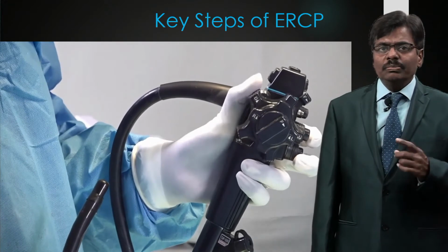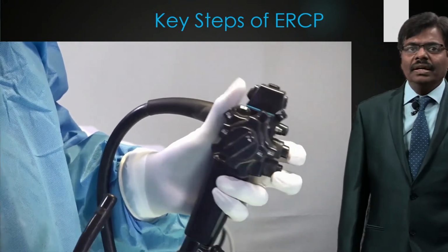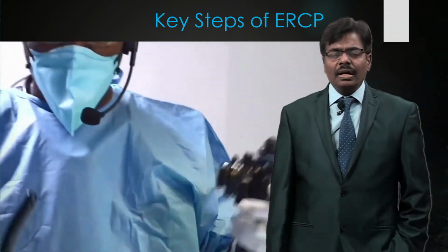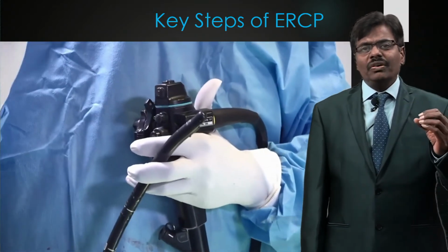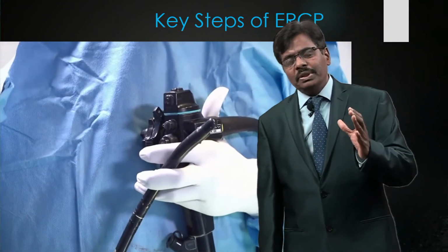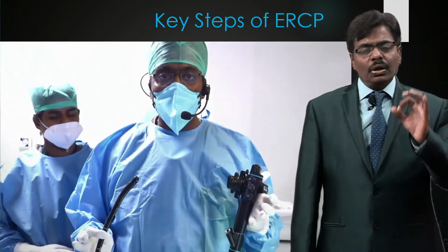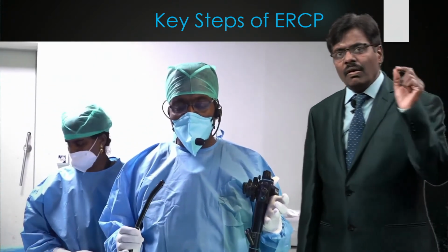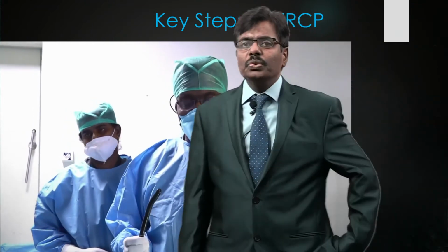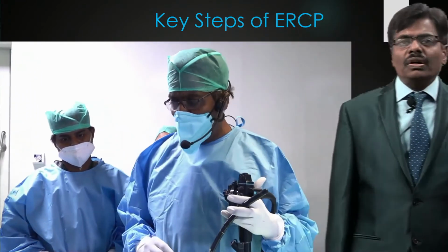So that is controlled. Big wheel, small wheel, next to this big wheel is the elevator, as you can nicely see demonstrated here. And this scope, what I am having here, is fairly a big scope. That is what we call a therapeutic ERCP scope, which has a diameter of about 10.8 and a working channel diameter inside, where all the accessories go, of 4.2. So very easily you can put a stent up to 10 French stent. So this is what we normally use.